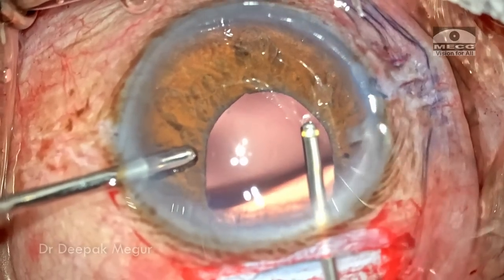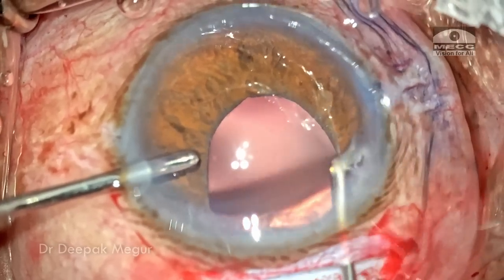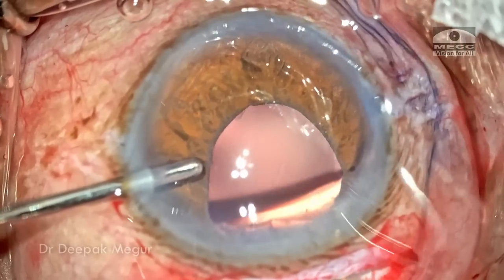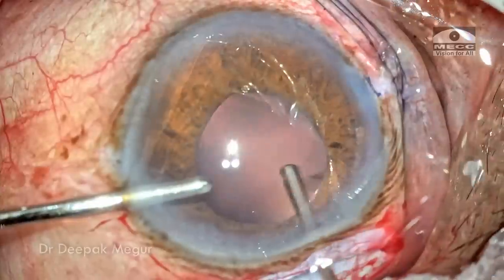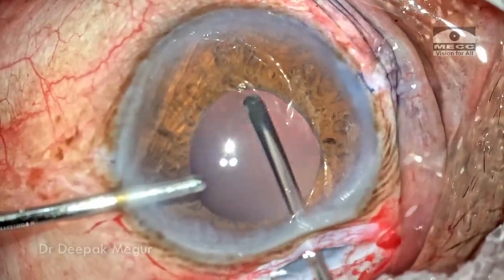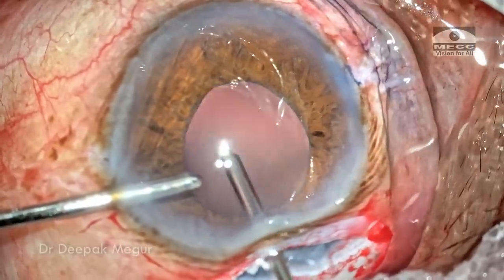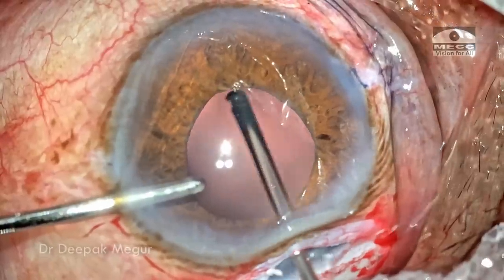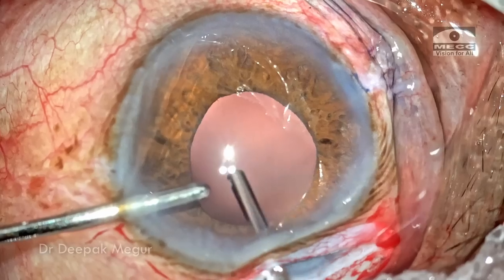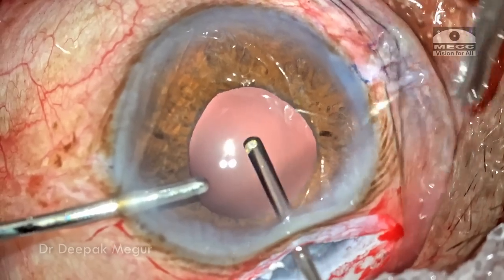By entering through the main incision I'm preventing the tunnel from collapsing. I'm pressing the probe of the cutter against the roof of the tunnel, preventing the anterior chamber from collapsing, and the visibility is also great because I no longer have these corneal folds. The vitreous which is prolapsed across the pupil into the anterior chamber is being taken care of. It's important to realize that doing an excessive anterior vitrectomy is going to make the eye extremely soft — I'm only going to do what is required, just around the pupil and below it.